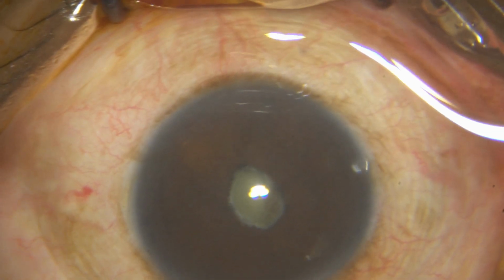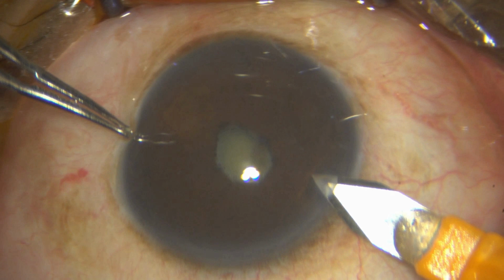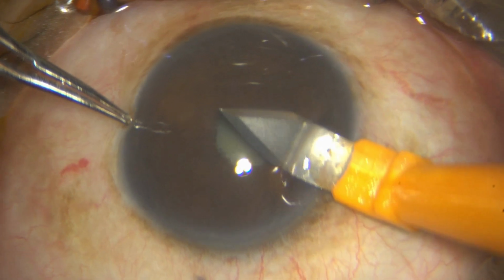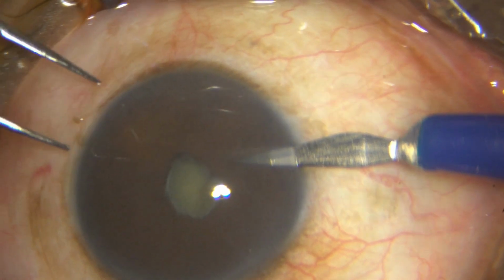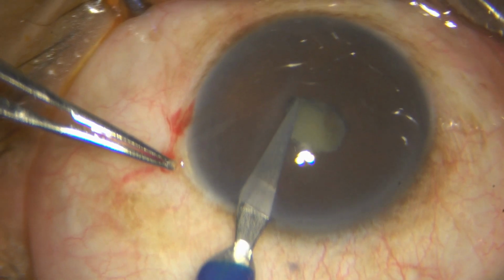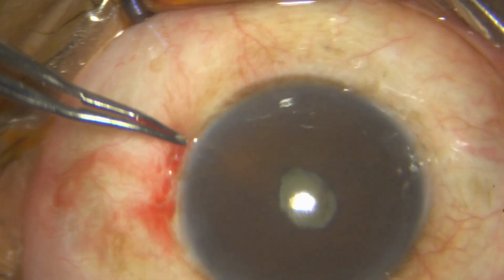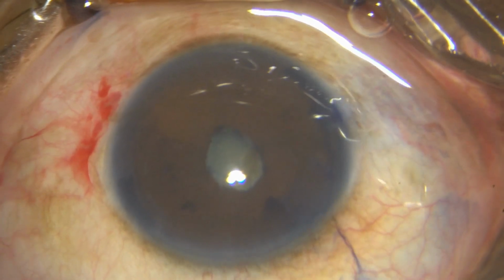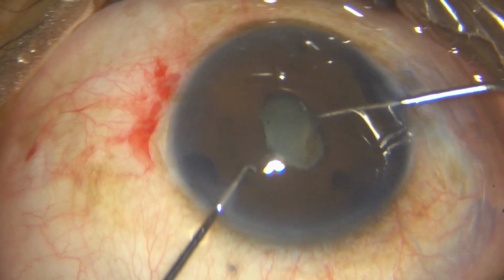So we have taken her up for surgery, knowing fully well there will be a lot of difficulties. So initially I put in my incision, and I already know that this has a dense fibrotic membrane. So I have gone ahead and pre-placed my incisions for the iris hooks. I do stain the capsule, although it's more of a membrane there, and I am trying to separate these synechae and this membrane with my Sinskey hooks.